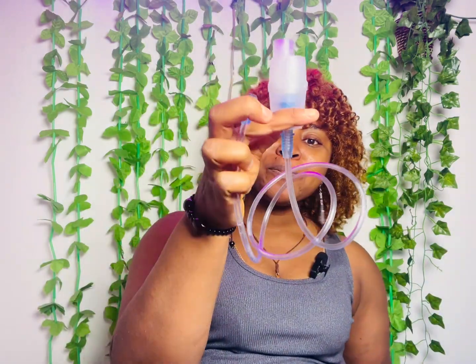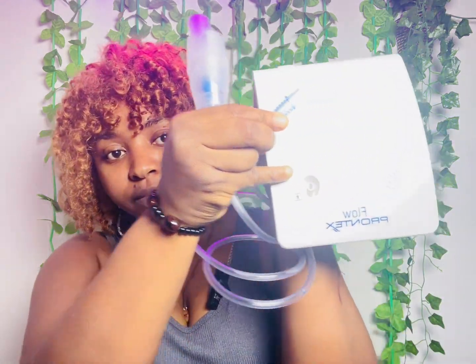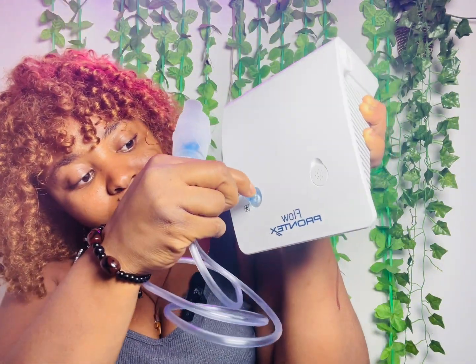Hope you understand. So after putting it underneath here, like so, your medicine is inside. You're going to take this other end part and put it somewhere here. This is the place you're going to put it, like this. And we have our medicine here, remember, like this.